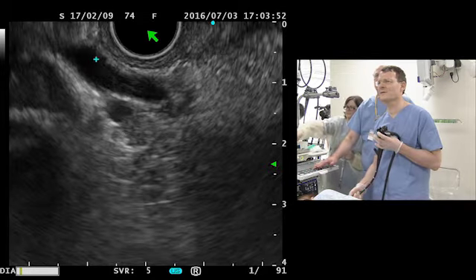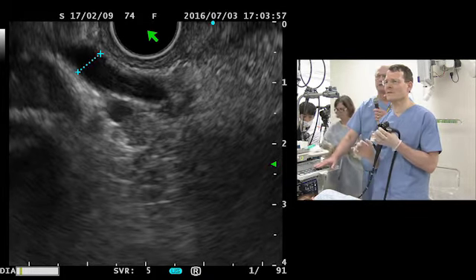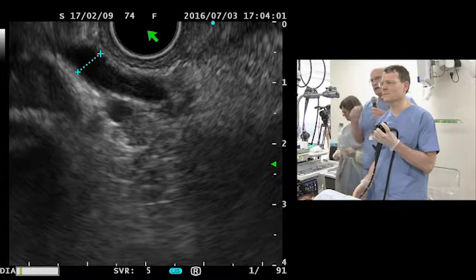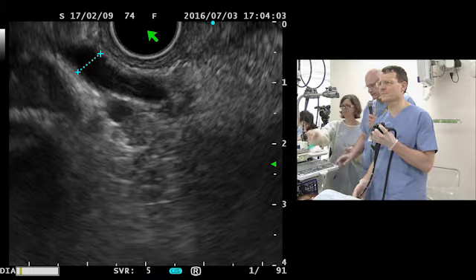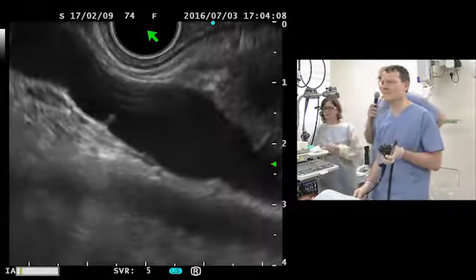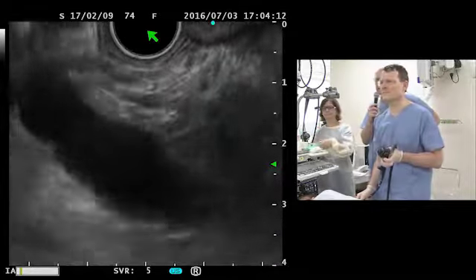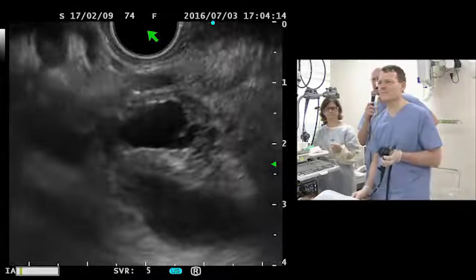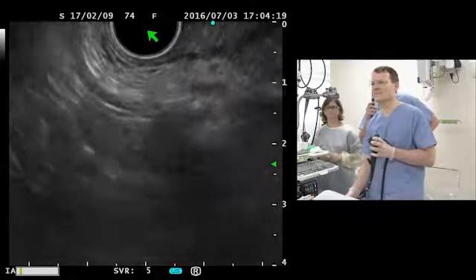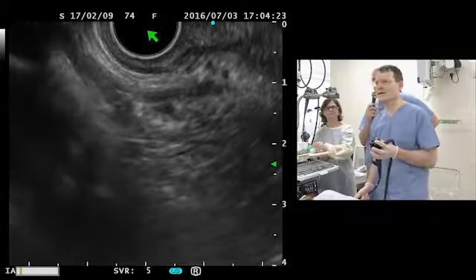This is another view here. Even out here, it's only 5 millimeters, so I don't think there is any dilation. And there's a rule of thumb that my partner Shyam Verderajulu taught me: if the pancreatic duct in the head is a greater diameter than the bile duct, that's a very significant sign for IPMN. So I think this patient has met that criteria.